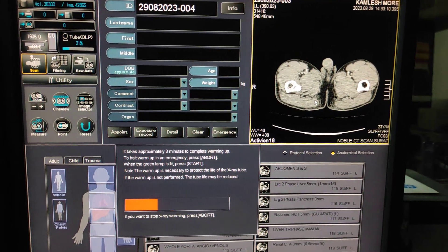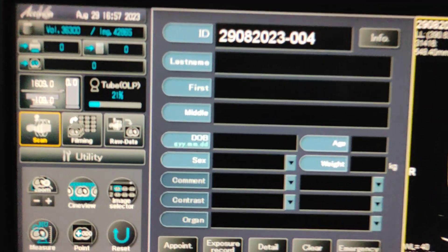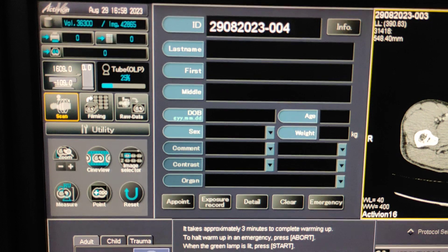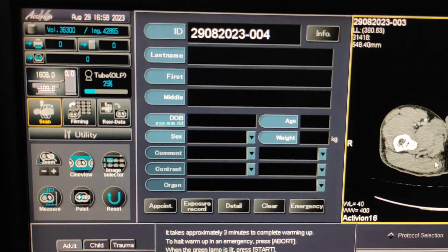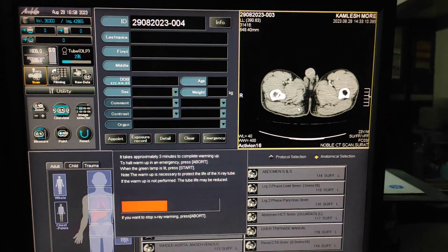Whenever you are doing angiography scans, your tube OLP should be below 50%. Around 20 or 30% will be ideal for scanning angio.